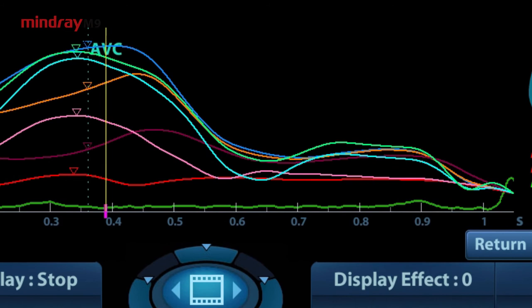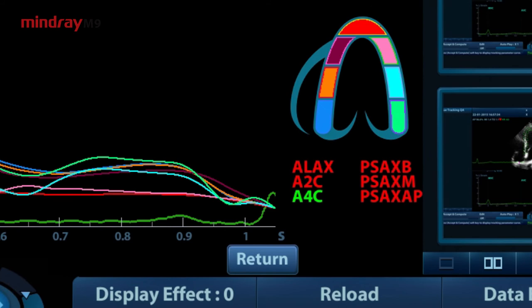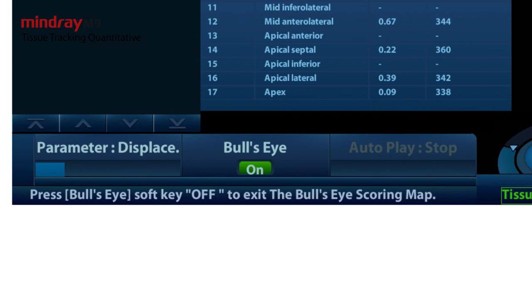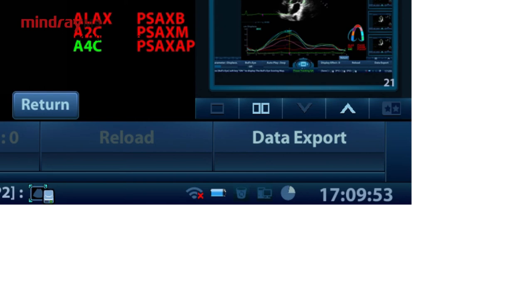Click accept and compute on the soft menu to calculate and display the curve. Adjust the parameters if necessary. Click bullseye on the soft menu to see the result. Click data export on the soft menu to export analyzed data. Click exit on the soft menu. This is all you have to do to perform an accurate quantitative tissue tracking analysis with your new Mindray M9 system.